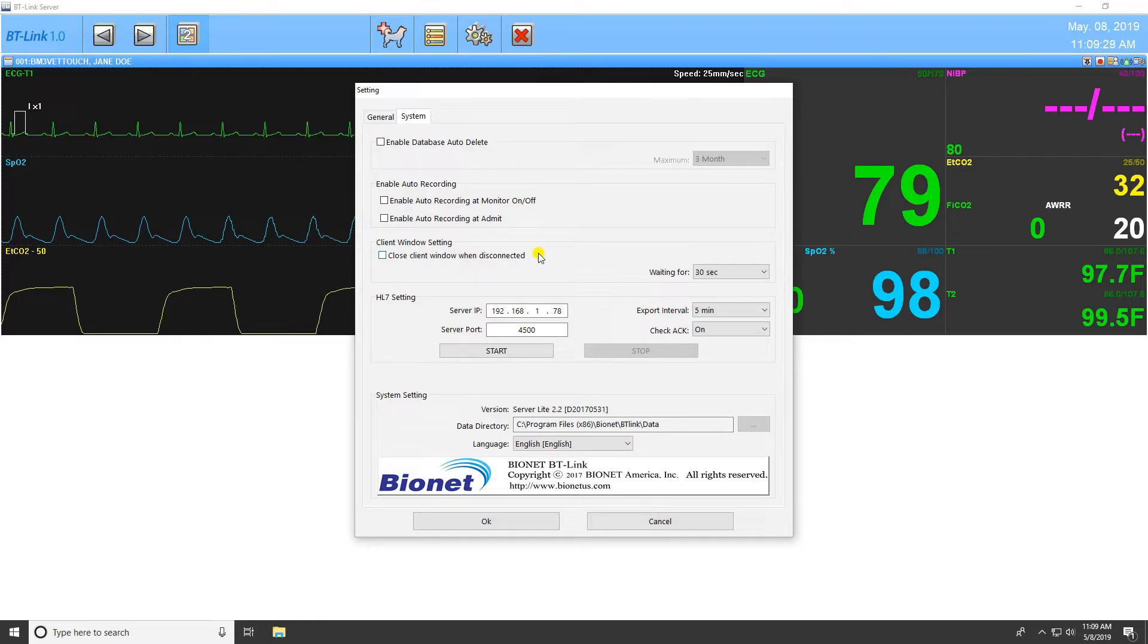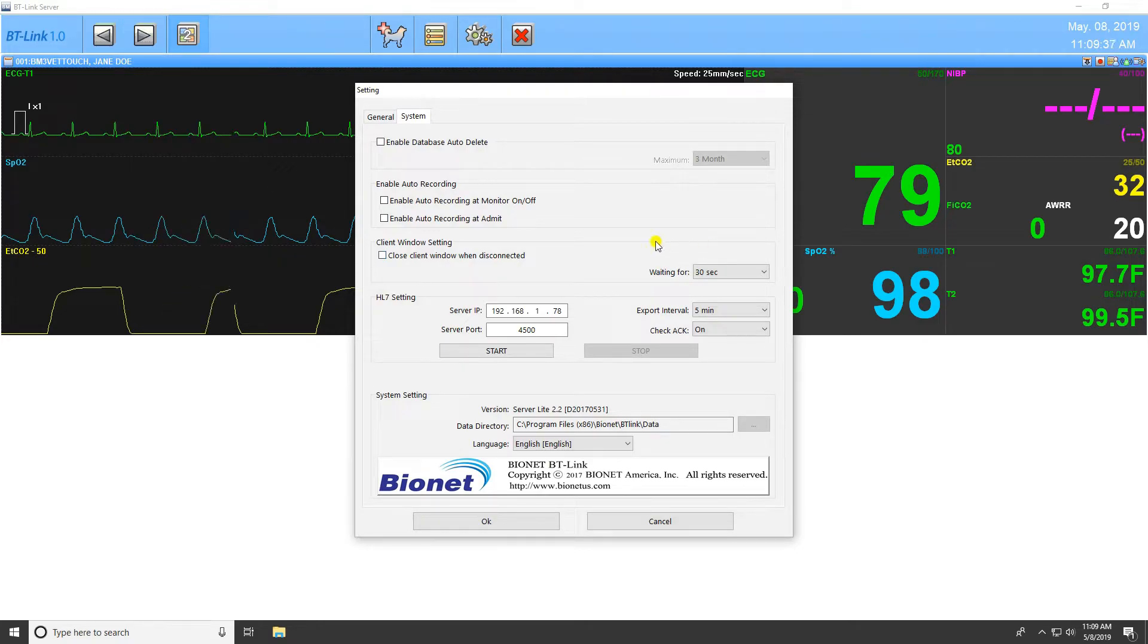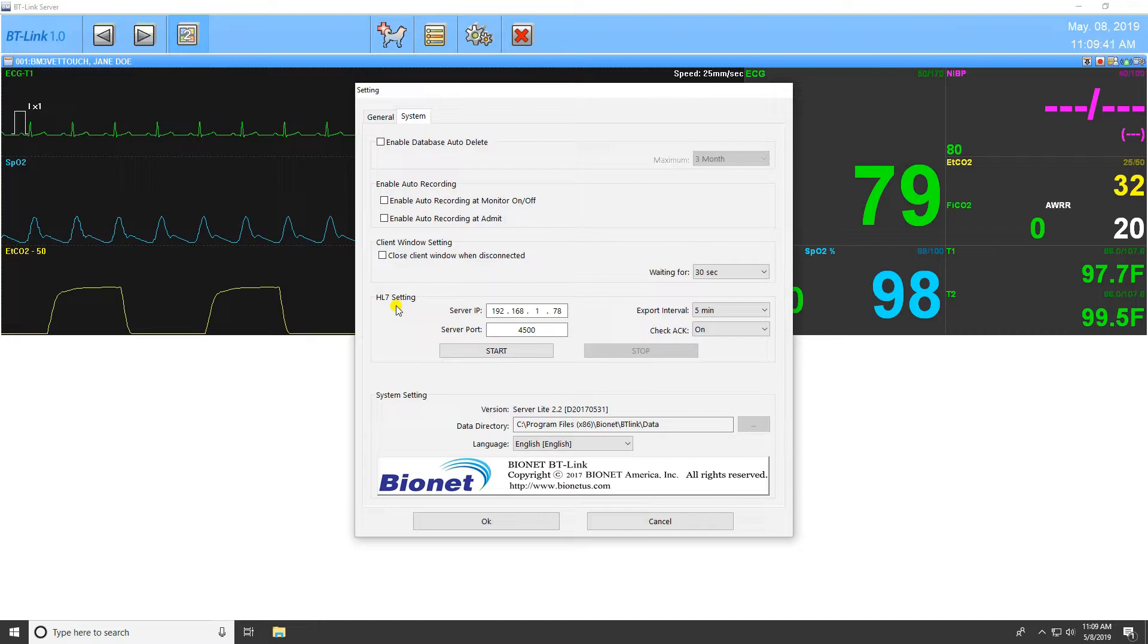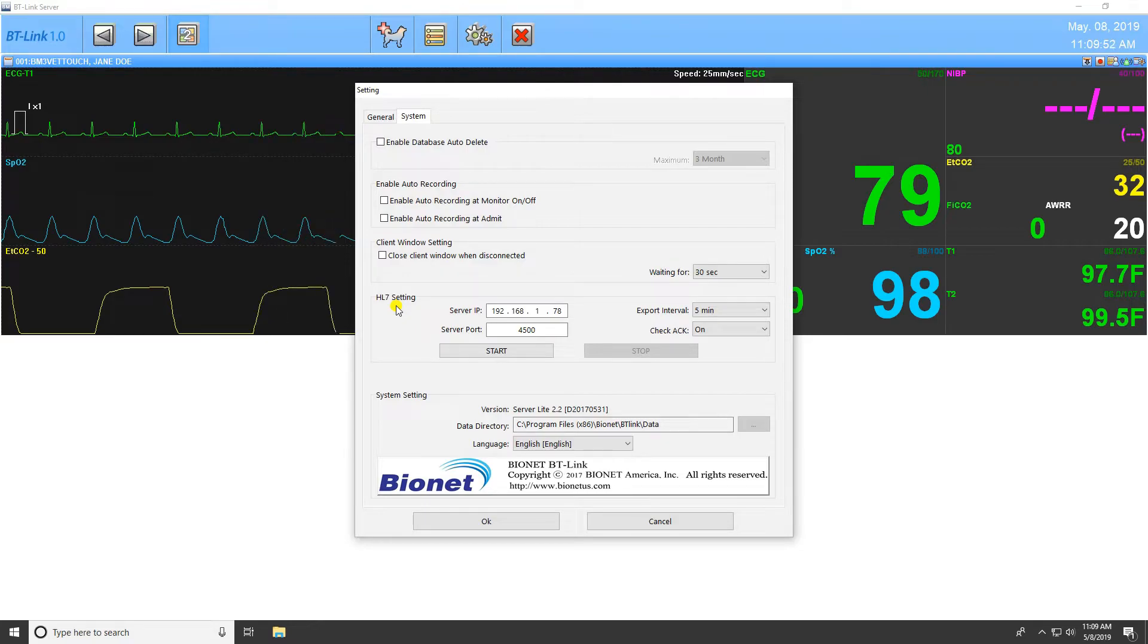Select the Client Window setting to enable the program to close after losing connection with the patient monitor and how long after disconnection for the program to shut down. The HL7 setting can configure IP information to send HL7 format data to an external EMS server. You must input the server IP and port number of the receiving server and decide the interval at which you would like the data to be sent.